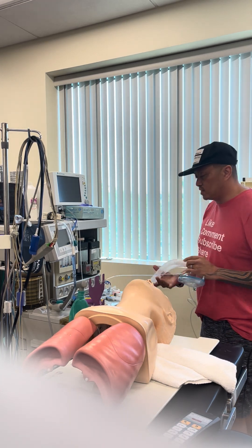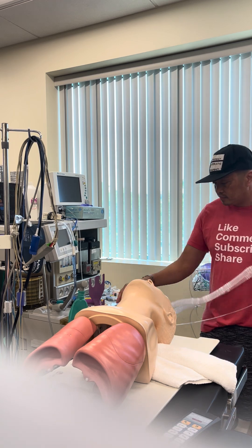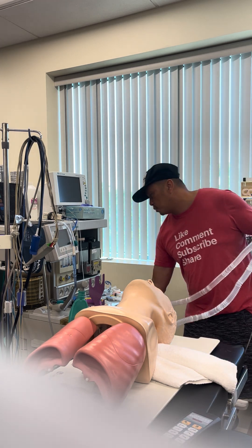Then I'll look at my breathing circuit. I'm going to extend it, make sure there's no kinks or bricks or leaks. My face mask is installed, it's the right appropriate size, and then my ETCO2 is connected all the way to my monitor.